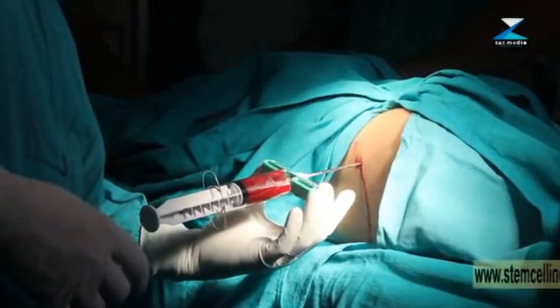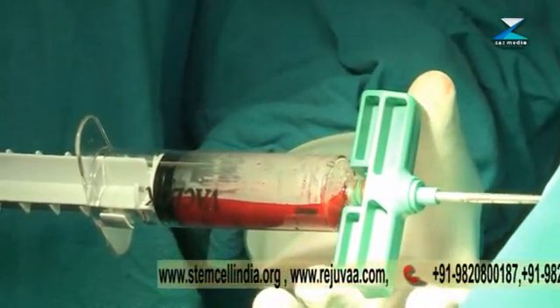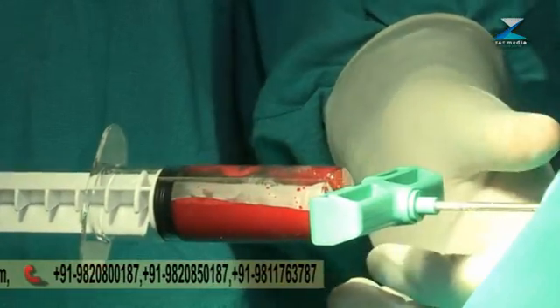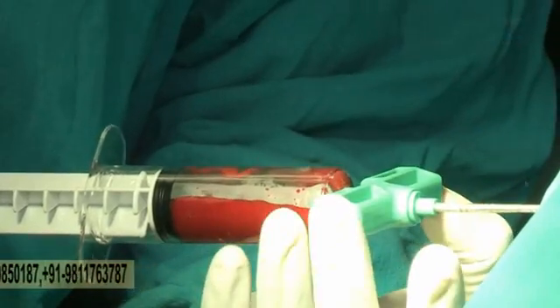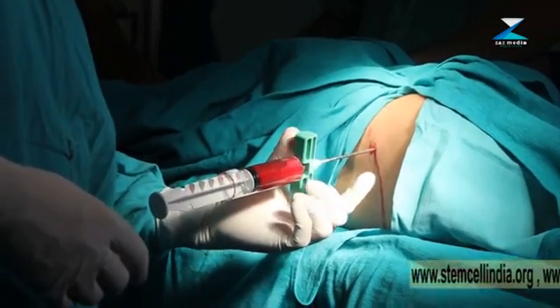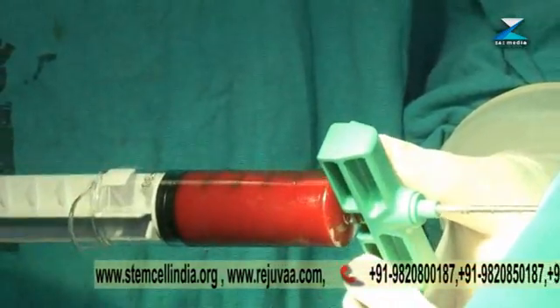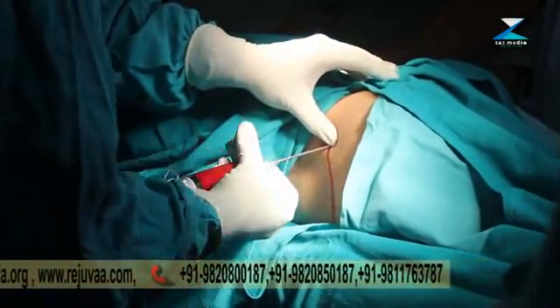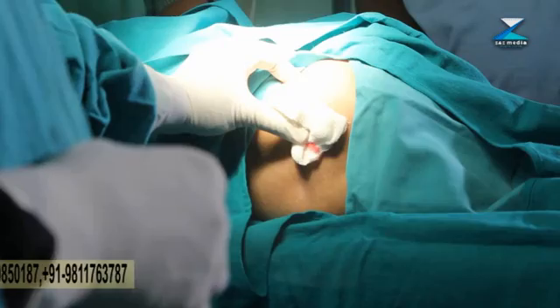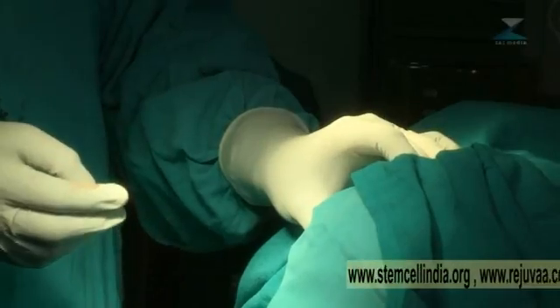This is a vacu-lock syringe made by a patented technique from BMAC — we need not pull it all the time and it collects the bone marrow very easily. Since the child is small, we will take out only 30 to 35 ml of bone marrow, and that is enough for us. Now we will process it. Thus we have collected the bone marrow from the posterior ILAC crest — Step 1 is over.